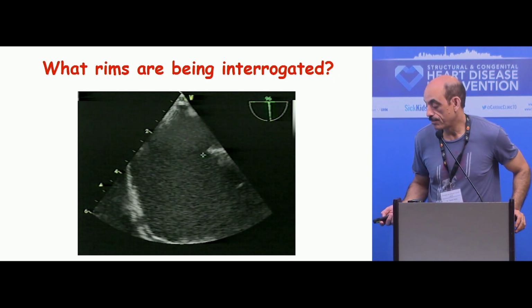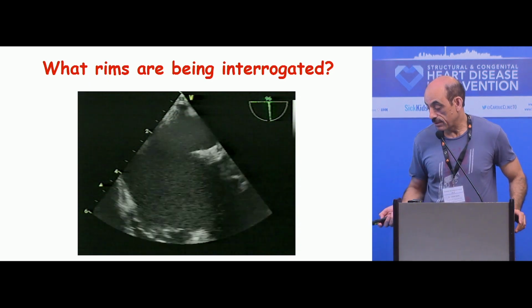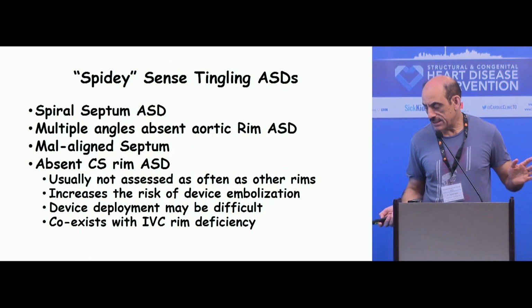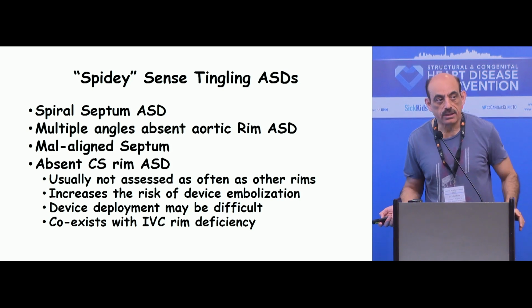Huh? So the pi never lies, right? It's SVC rim, and bottom will be the IVC rim. Now, Spidey, since I have time, 5 minutes? No, thank you. Thank you.